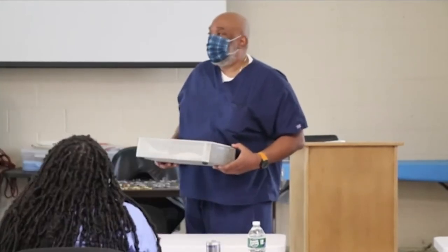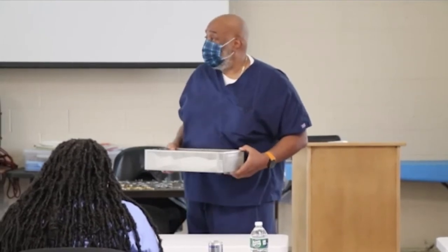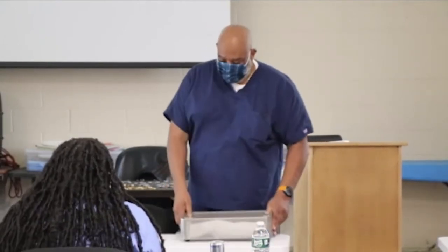Why we want to make sure that they're always intact, because if they started to chip or get damaged and we put them in the container, after they go through the sterilization process and disintegrate, they might start to look like bioburden or some foreign debris. And anything that shouldn't be in there, when they open it up in the OR, they have a right to disqualify the tray because, as far as they're concerned, it's contaminated, okay? So what goes in next?